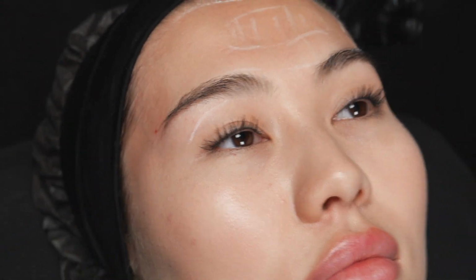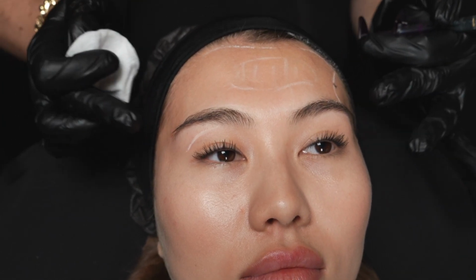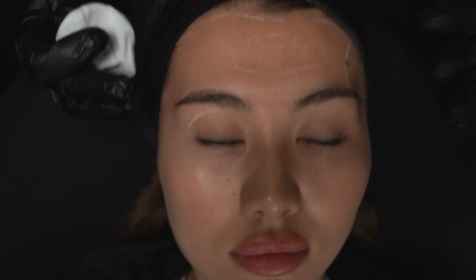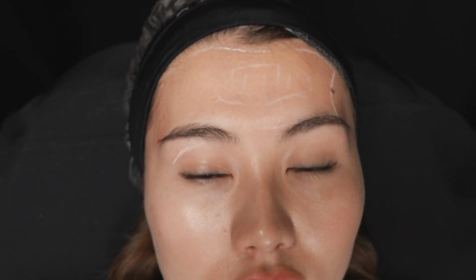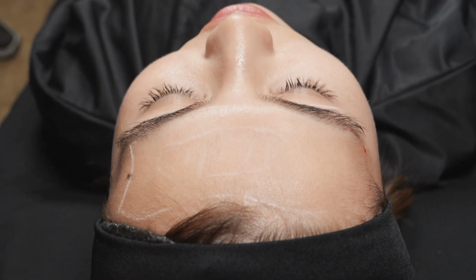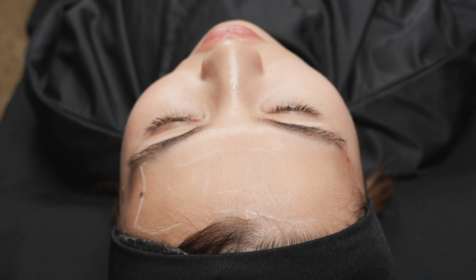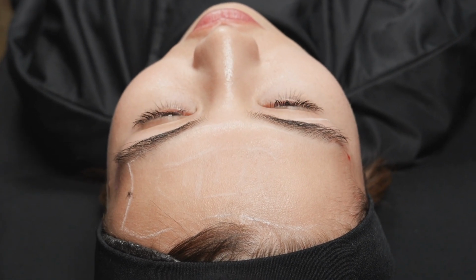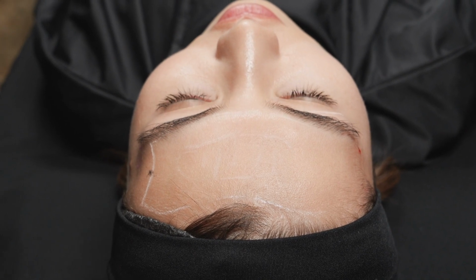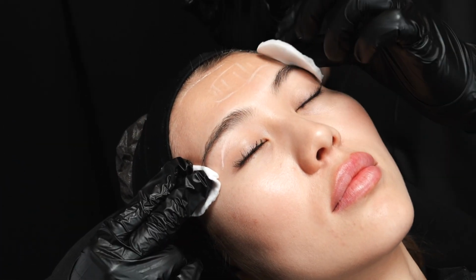И мне кажется, я не знаю, как вам видно, но когда я встану за пациенткой, я вижу разницу. Посмотрите. Одна сторона отличается от другой. Мне видно, что она чуть-чуть подскочила. Да, вот, замечательно, видите? Прекрасно. И посмотрите, правая сторона просевшая, тут буквально 0,04, RHA 4. И я продолжу работу на лбу.